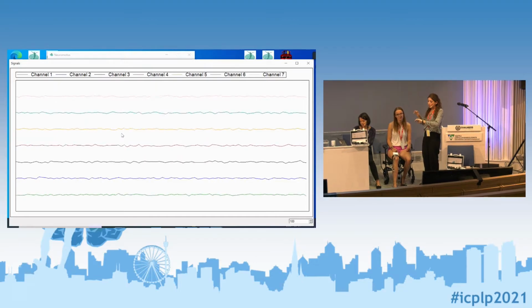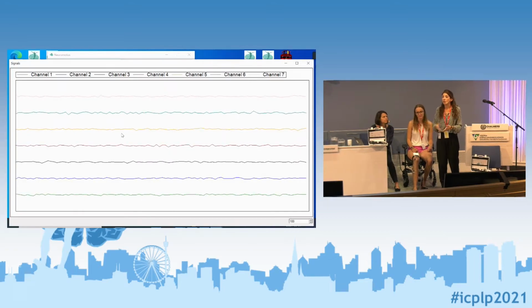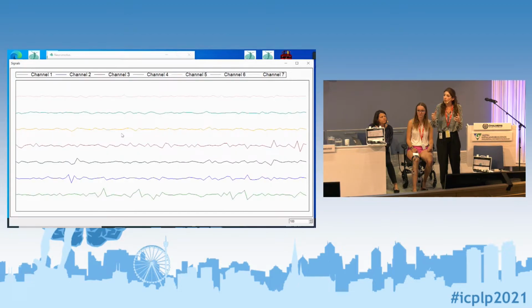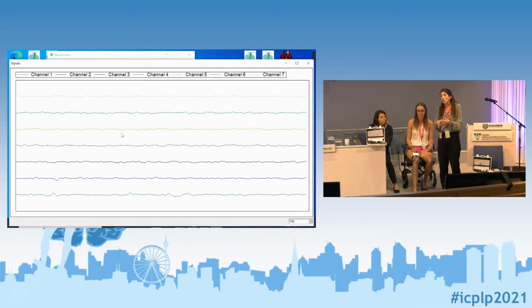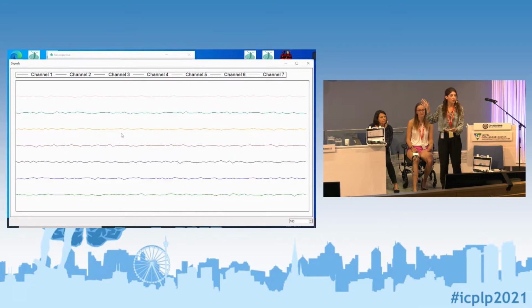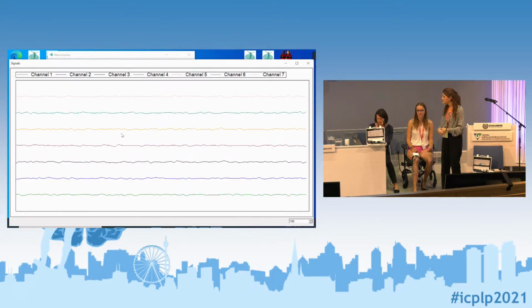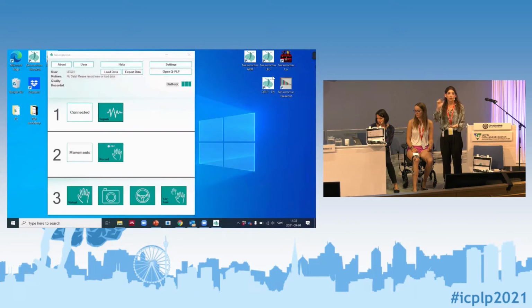Another important part in this section is that the participant learns to relax. As Kate was explaining in her treatment in the morning, quite commonly the patients feel like the phantom limb is cramped or the muscles are constantly cramped, and the relaxation part is quite complex for them. So in this stage, we also teach them how to relax, so we can practice both. Once we are happy with our signals, it means we placed the electrodes in the correct place. If we don't see muscle activity, it means we need to change our electrodes. Then we go to the recording session.